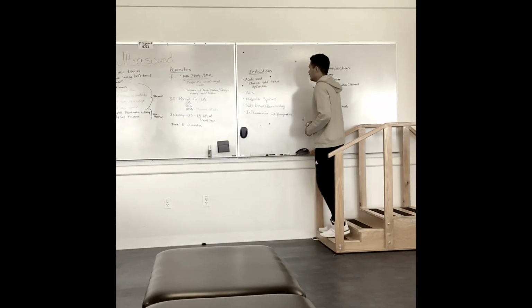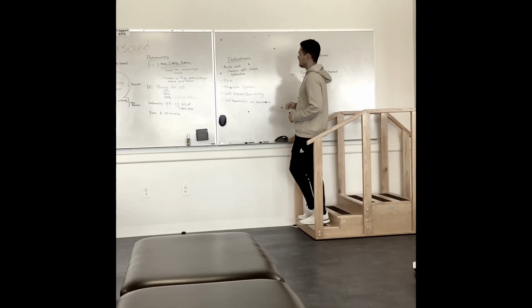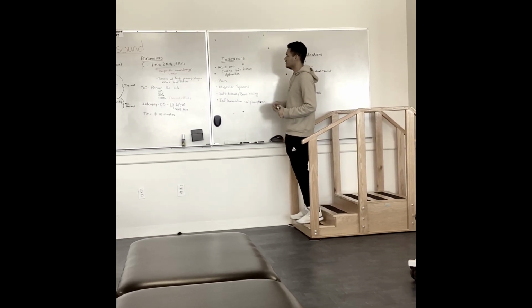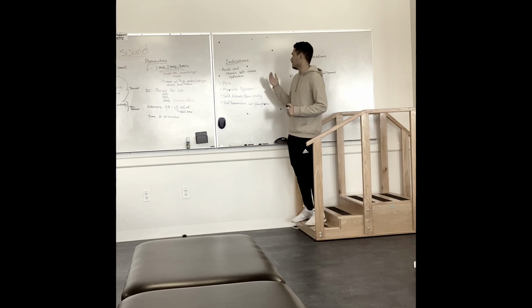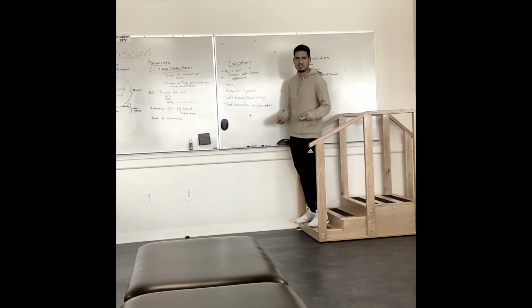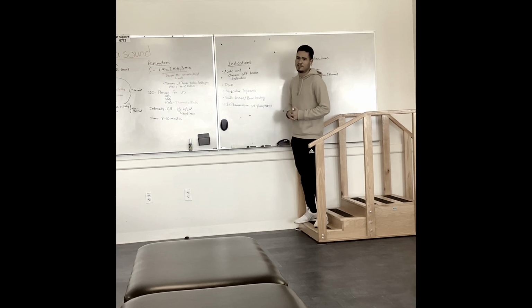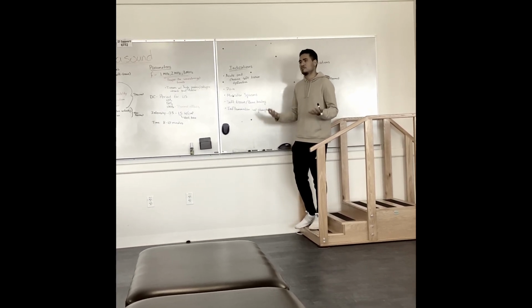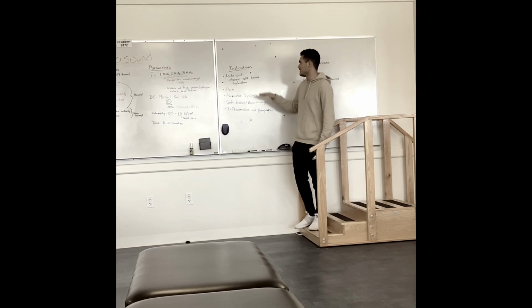All right, so going over here, we'll start with indications this time. For indications on when to use ultrasound, you want to use it especially if you're trying to help repair acute and chronic soft tissue dysfunction. So if they have acute or chronic soft tissue impairments, then you're going to want to use ultrasound.